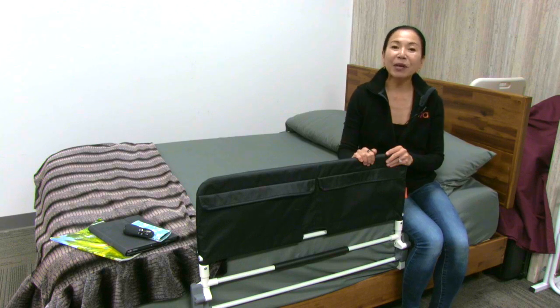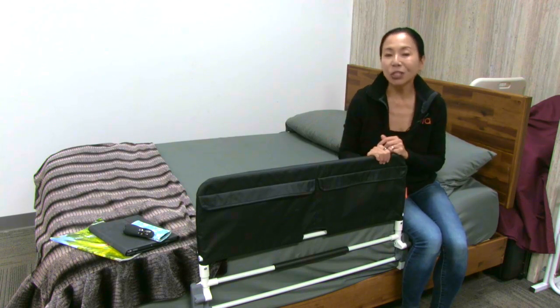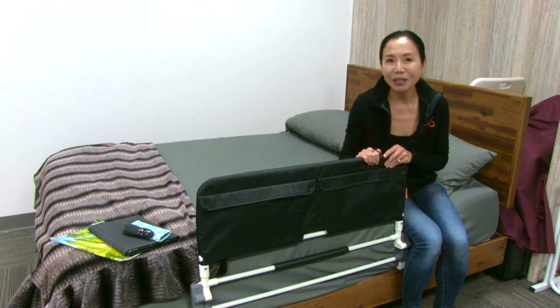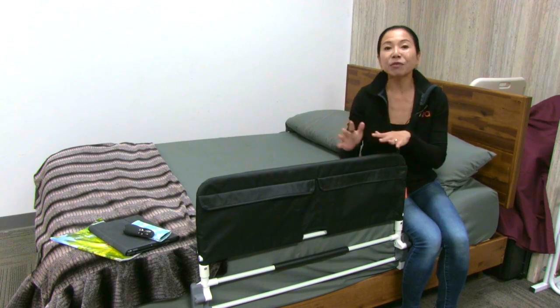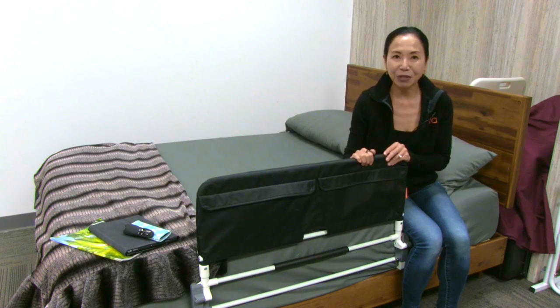Hi. This video is about the NOVA Folding Bed Rail. I'm going to go over our mission of fall prevention, why I love this product, and then after this video you can see the quick and easy assembly of this folding bed rail.